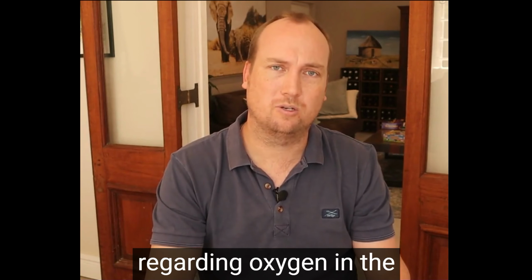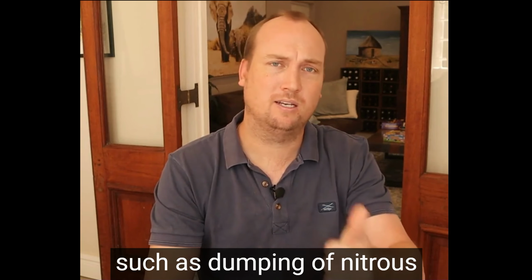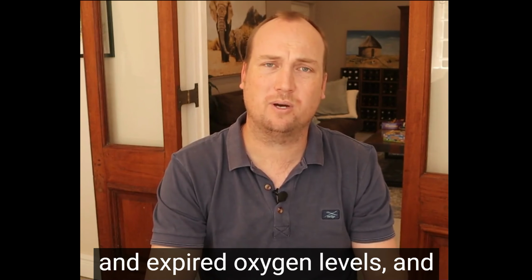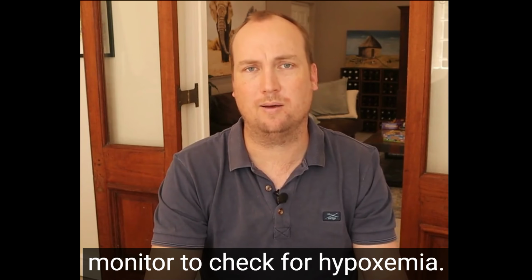There are other safety checks regarding oxygen in the anesthetic machine check, such as dumping of nitrous oxide, an oxygen alarm, oxygen sensors to measure inspired and expired oxygen levels, and then we of course have a SATS monitor to check for hypoxemia.